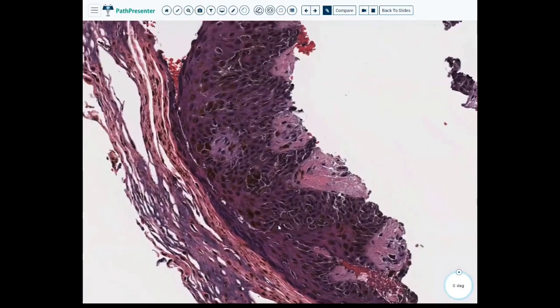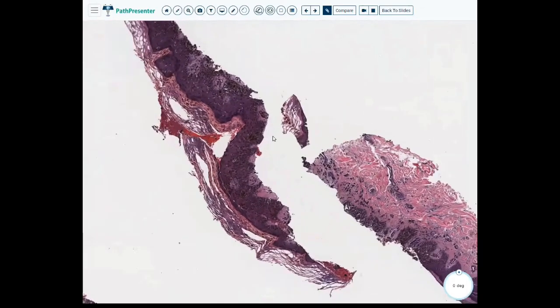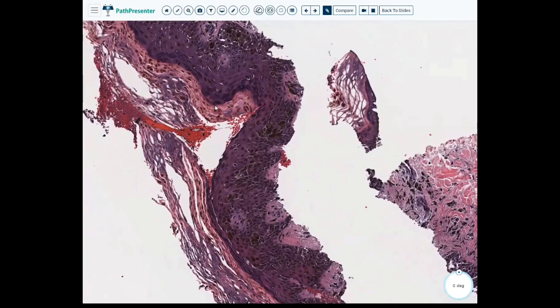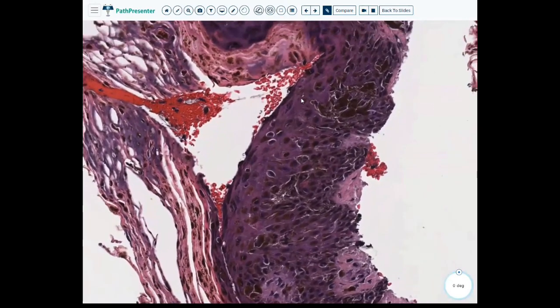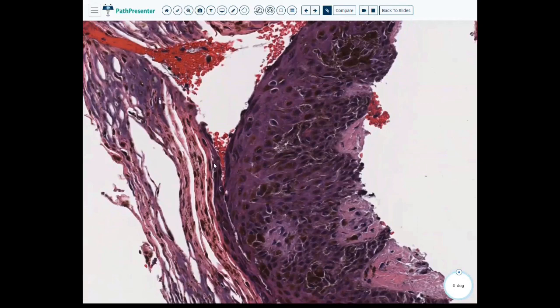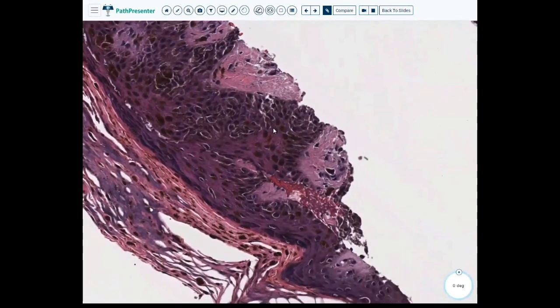I think this is the piece to look at, this big middle piece. So if you're spending some time on the case, I say that because here is your surface. So here's our keratin, which we can still see pigmentation within the keratin and some of these cells. And what we have here is these are melanocytes. Okay, some of them are pigmented heavily, some aren't.